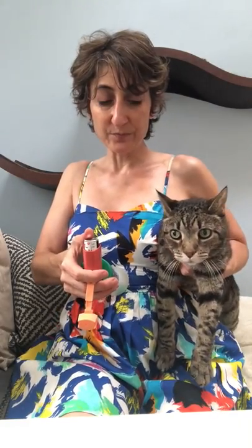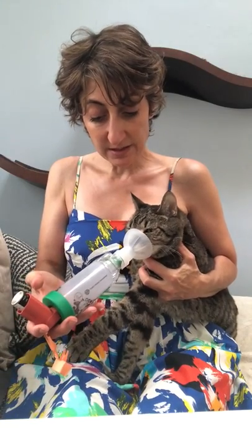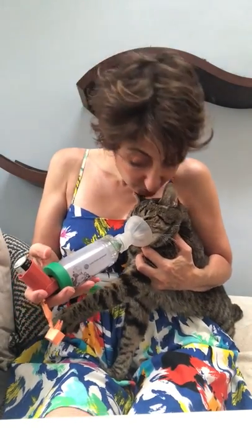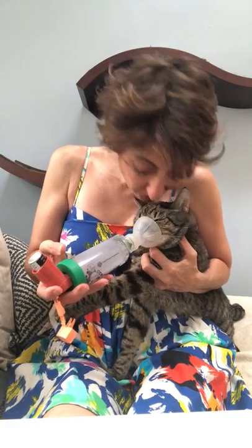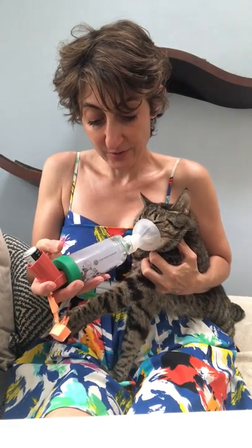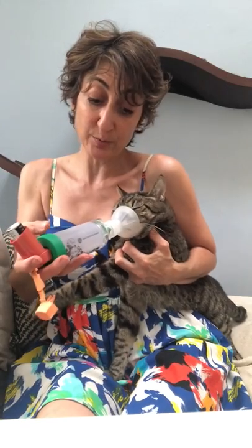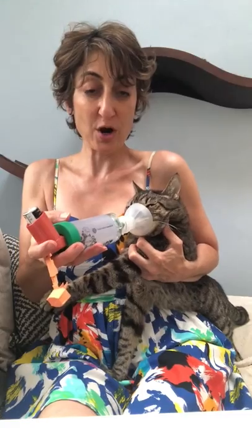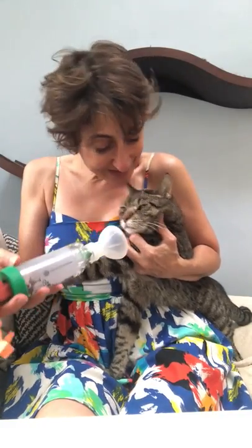This way it doesn't freak him out when you have it over his mouth. So then I just quickly go like this and I'm looking at the paper. One, two — good boy — three, I've got a pretty firm grip on him. That's three, and then four. And then he usually gets a treat.